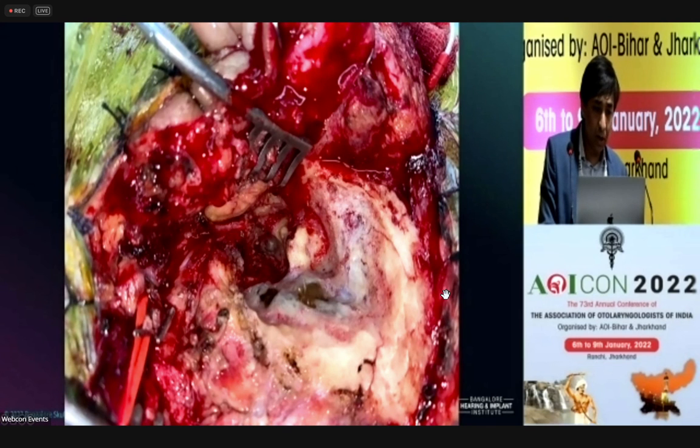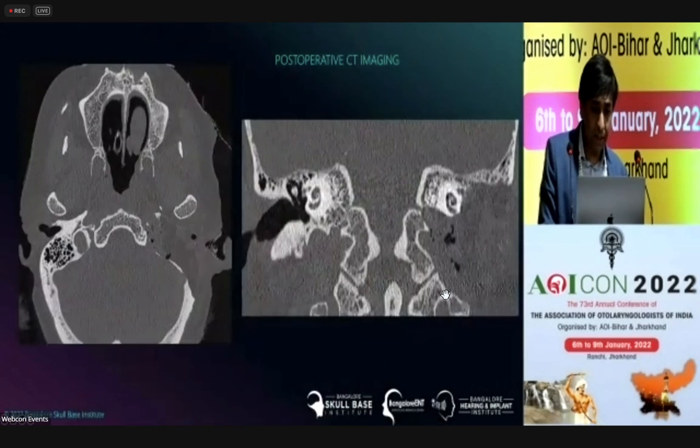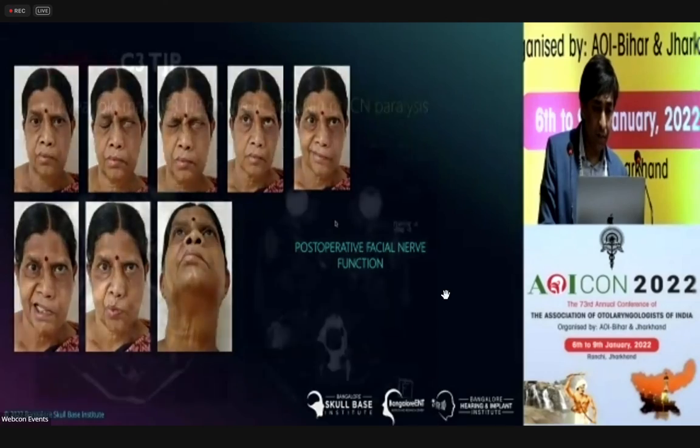This is retrocarotid. Carotid is here. We are behind the carotid. Okay, so this is the carotid. This is behind the carotid. Lower cranial nerves are here going intracranially here. So complete tumor resection posteriorly. So obviously rerouted nerve and this.